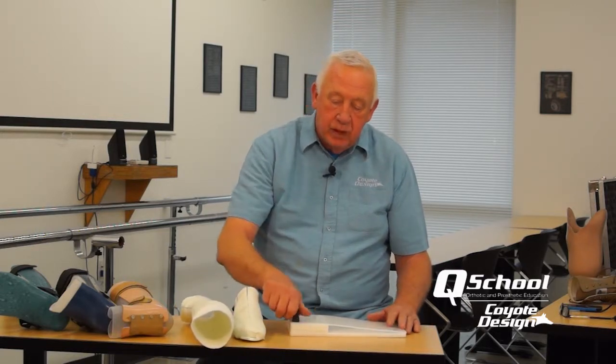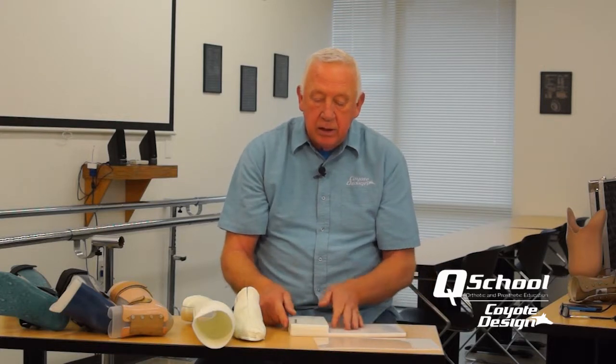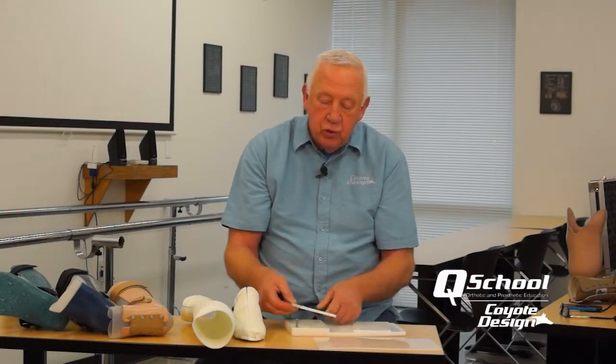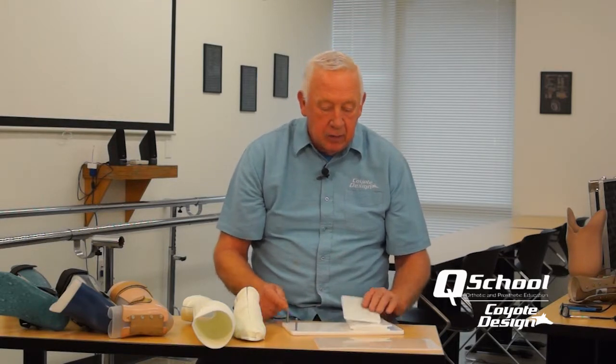One component of this is our adjustable heel height plate. We have this set up so we can go from a zero heel height to a three-quarter inch heel height depending on the shoe selected by the patient. Most shoes suitable for wear with an AFO are flat inside and have an insole pad, and three-eighths inch is a really common heel height in that regard.